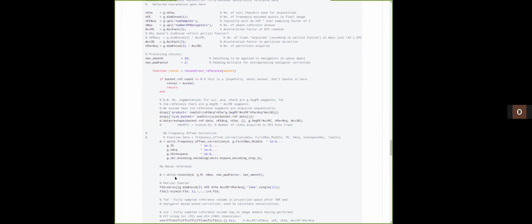And what's being returned is D dot F1D, used after the first Fourier transform. And crucially, I have kept hold of the dot data, should I want to use it, but also the dot header element.